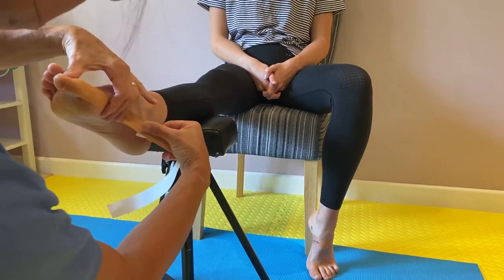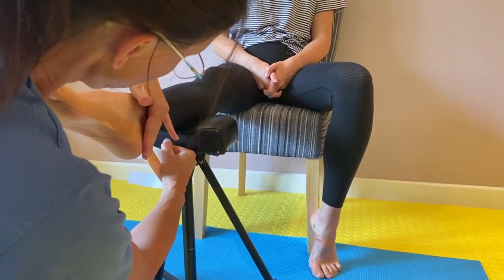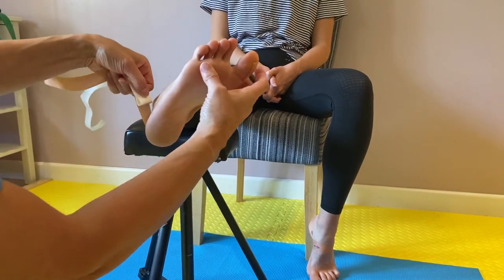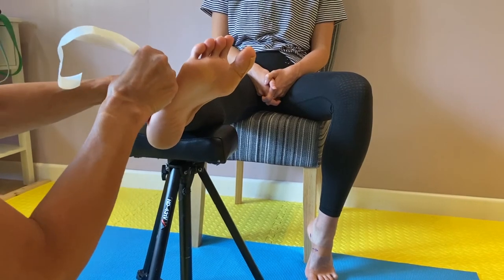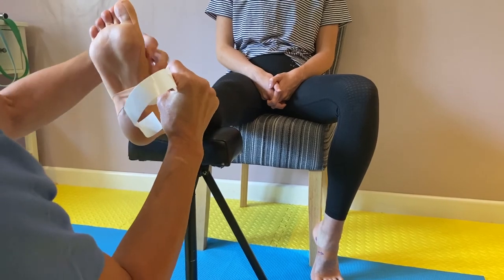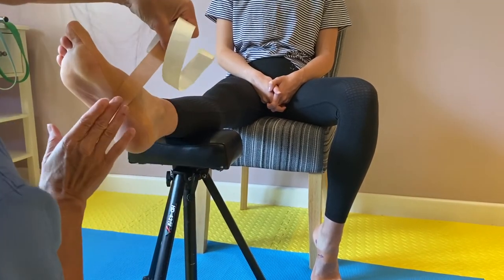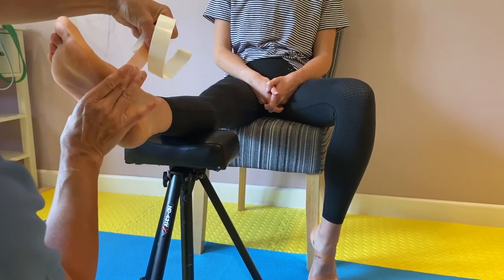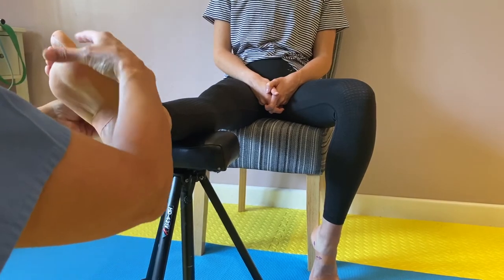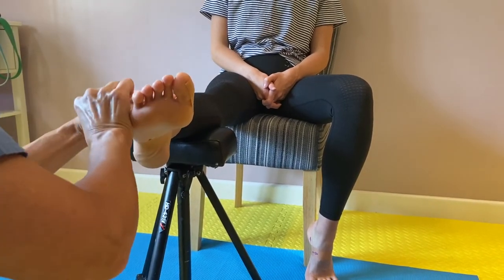Sticking it down nicely, it goes around the rim of the heel — I'm peeling the backing off as I go. As we come around the foot, we change direction to go underneath. I'm just going to stick that bit down a little bit more, and then we're planning to come up underneath just there to give a little bit of rise to that area. Give it a really good stretch, and that helps to support your foot really well, then just place that down.